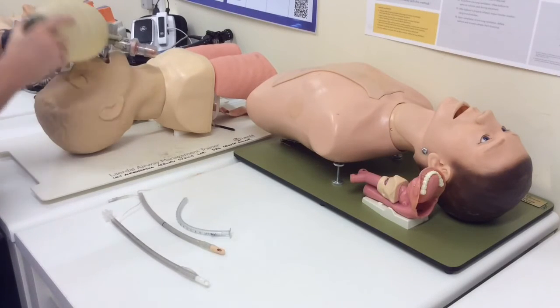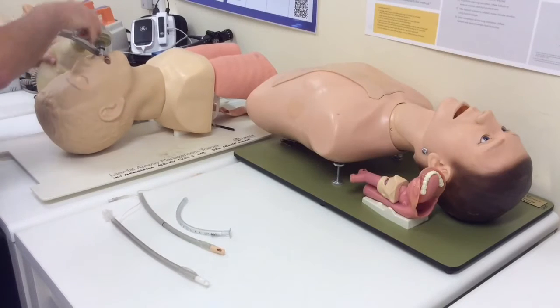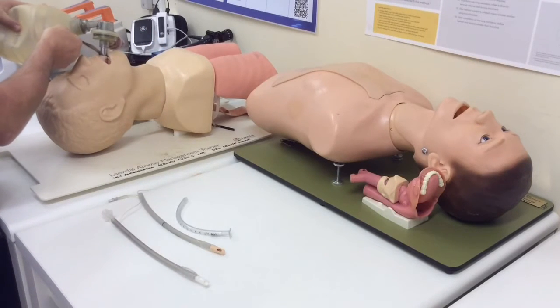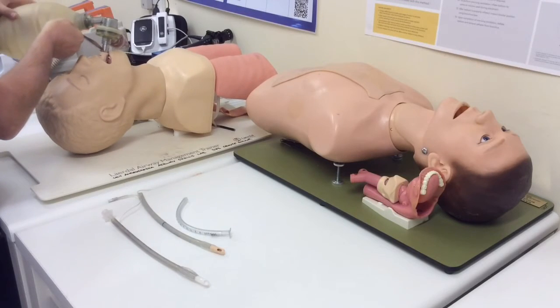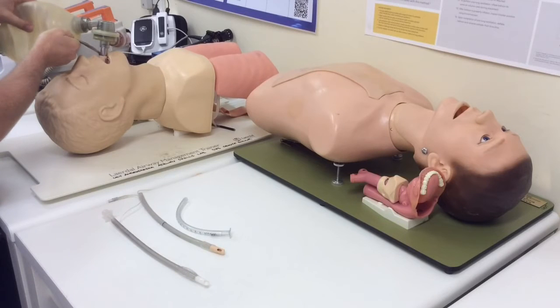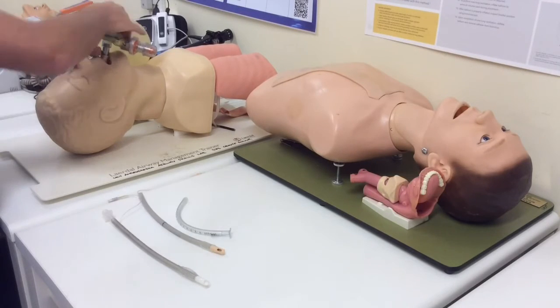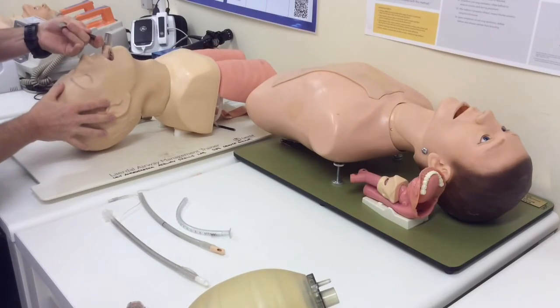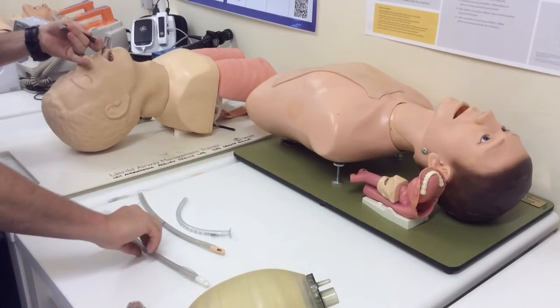So now, I'm going to perform what's called the Chandy maneuver, named for Chandy Verghese, who describes, and I'm going to move the Fastrach backwards and forwards in the sagittal plane like this until I obtain the position with the optimal ventilation. Right, there I found it. Now the second part of the Chandy maneuver is that I'm going to lift this whole device as if I was lifting with a laryngoscope to bring it into good apposition with the glottic opening.